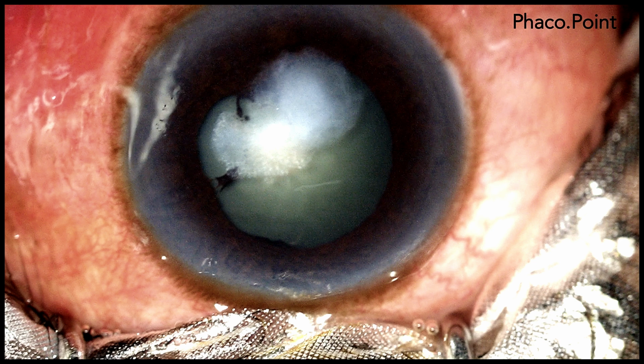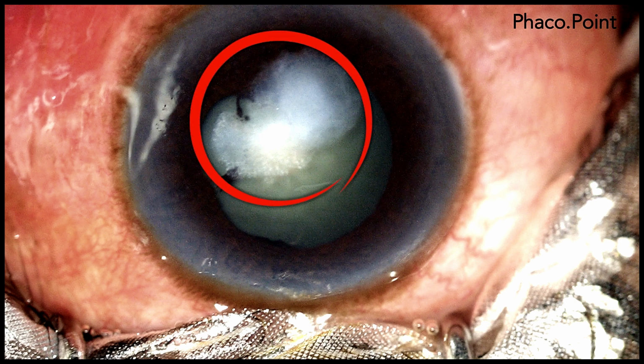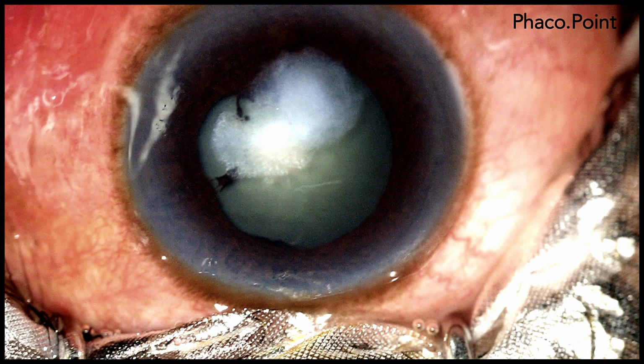This patient has a grade 2 nuclear sclerosis, a mid-dilated pupil, posterior synechiae inferiorly, and a significant corneal opacity in the lower half of the cornea. Let's now move to watching the surgery and understand the principles in managing a patient with a corneal opacity.